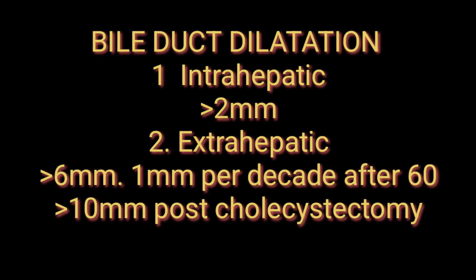Bile duct dilatation can be intrahepatic or extrahepatic. For intrahepatic, more than 2 mm is considered dilated; less than 2 mm is normal. For extrahepatic biliary channels, more than 6 mm is considered enlarged or dilated. The rule is 1 mm per decade after 60 years — so at age 70, normal is up to 7 mm, and at age 80, normal is up to 8 mm.